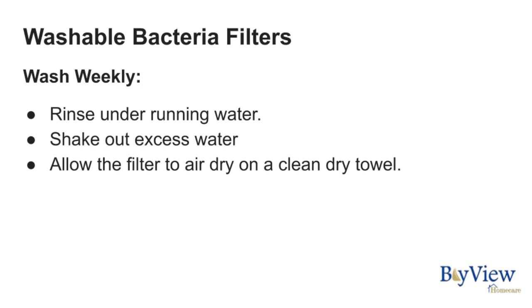Rinse the bacteria filters by running them under the faucet. Shake out excess water and allow the filters to air dry on a clean dry towel.